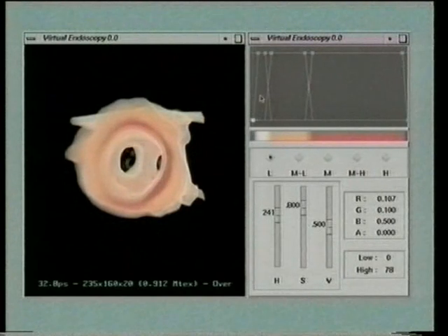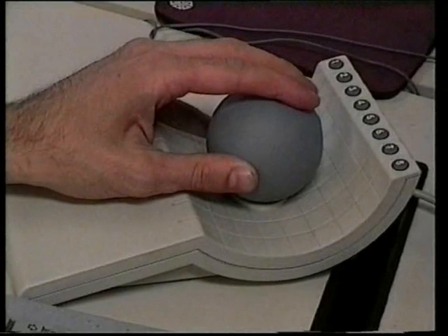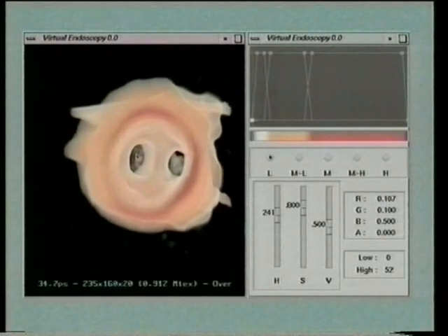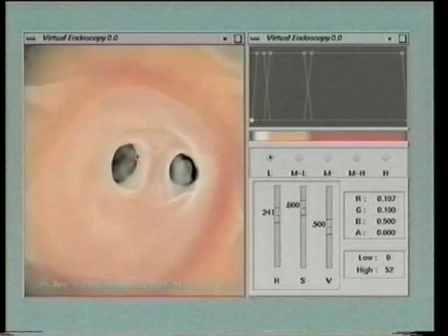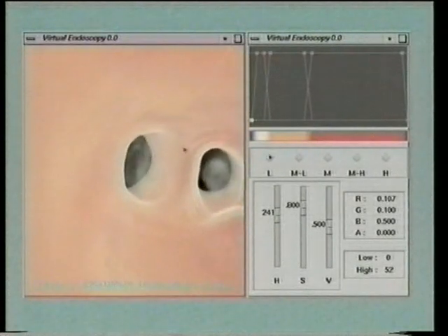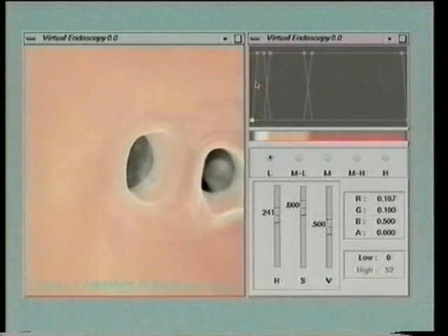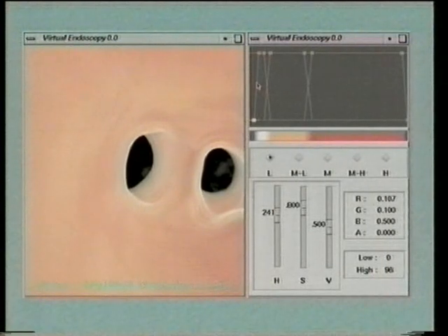The full potential of volume rendering is exploited when offering users real-time viewing and interaction. Here a space ball controls the endoscopic camera. Device input is interpreted as forces and torques applied to a virtual camera model. A viscous friction field proportional to volume opacity helps to confine the camera in cavity interiors during navigation.